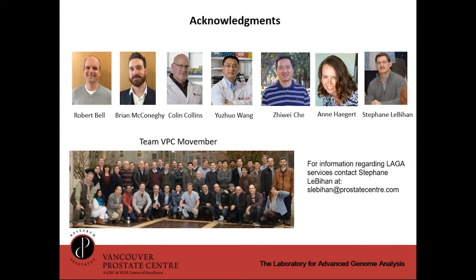Great, thank you. And yes, we have used it on other types of captures as well, as we've had customers use it with targeted sequencing. Actually, with the Multiscale Reference, another early access user presented their data at the recent AACR meeting as well. They were very pleased with the results on their targeted panel data.